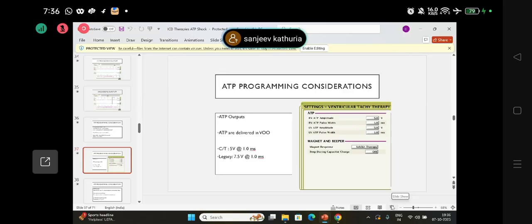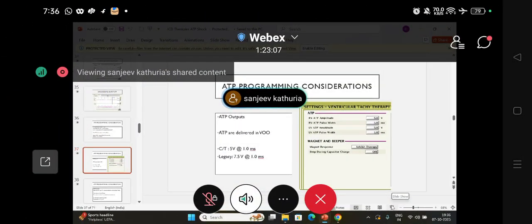Then you can make it 40. But if you're doing it for secondary, make it 40 because 15 will be ineffective and will cause him the same pain. So let the first one take care of it. The first should be 40 joules.